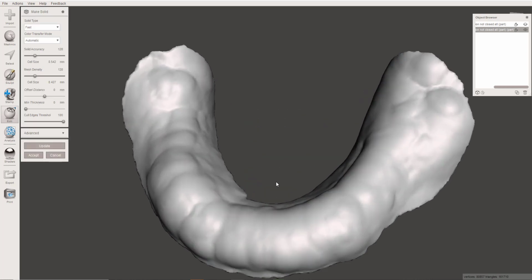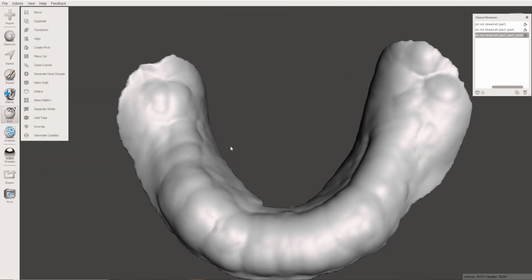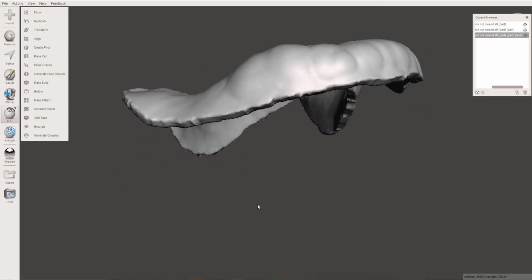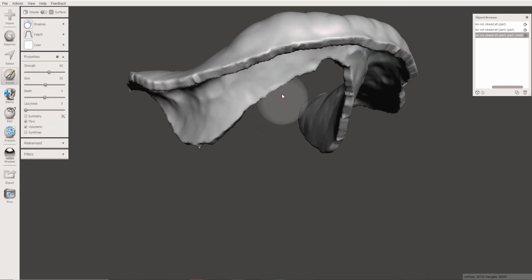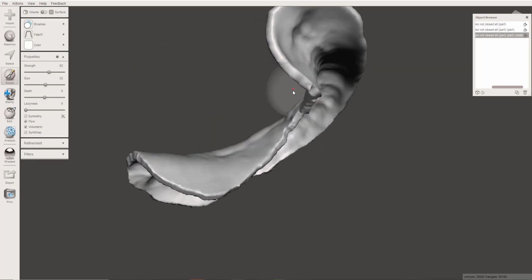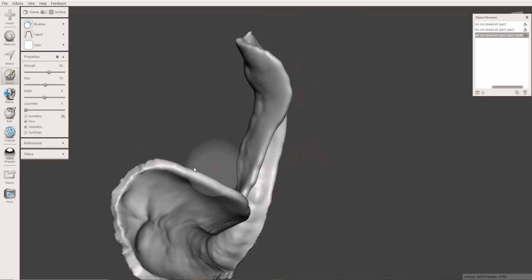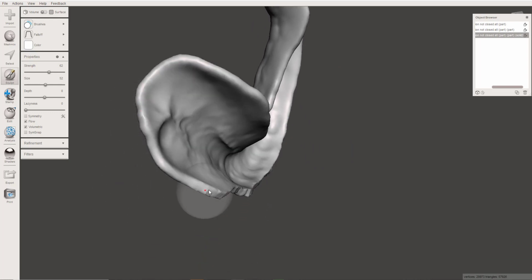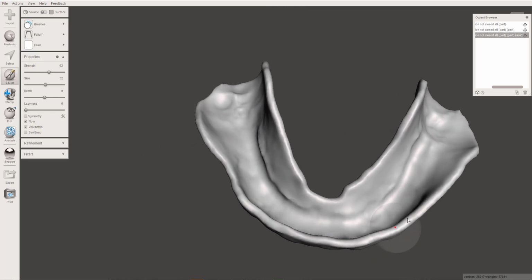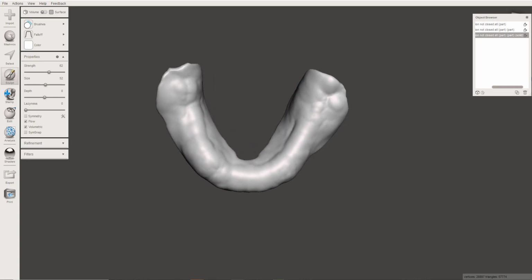And as you can see, what that does, it just turns this into one uniform solid. That doesn't have all those areas of mesh crossing over it. You're still going to have a little roughness on the boundaries. That's not a big deal. Just, if you want to smooth it now, or just whenever you print that, you can get rid of those. So I'll just, since I'm doing it digital, I'll just go ahead and hit this very briefly with the Robust Smooth tool. Get rid of all those little spikes that may have occurred at the boundary. All right. So there is the base of our tray.